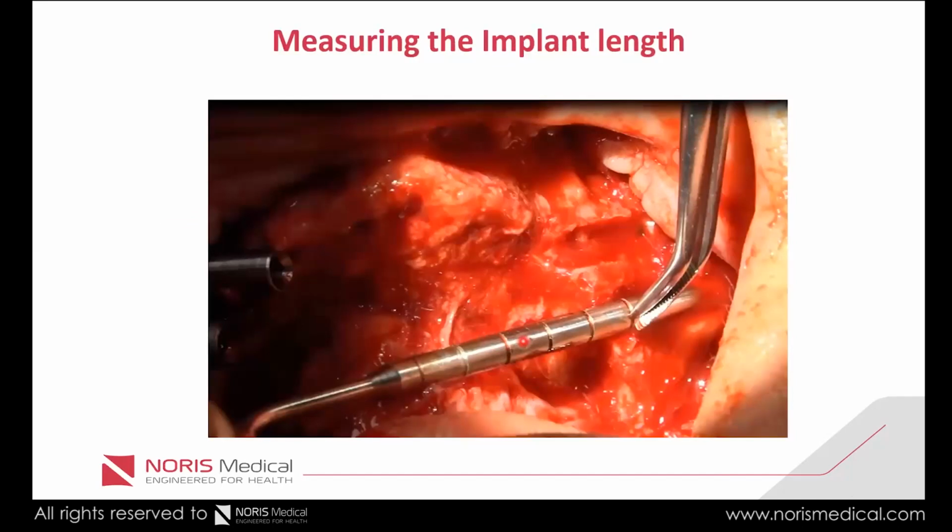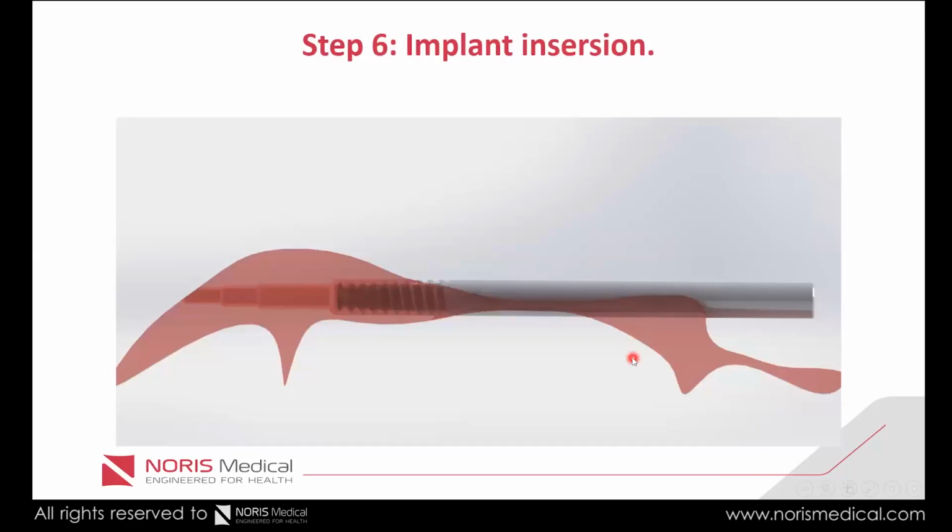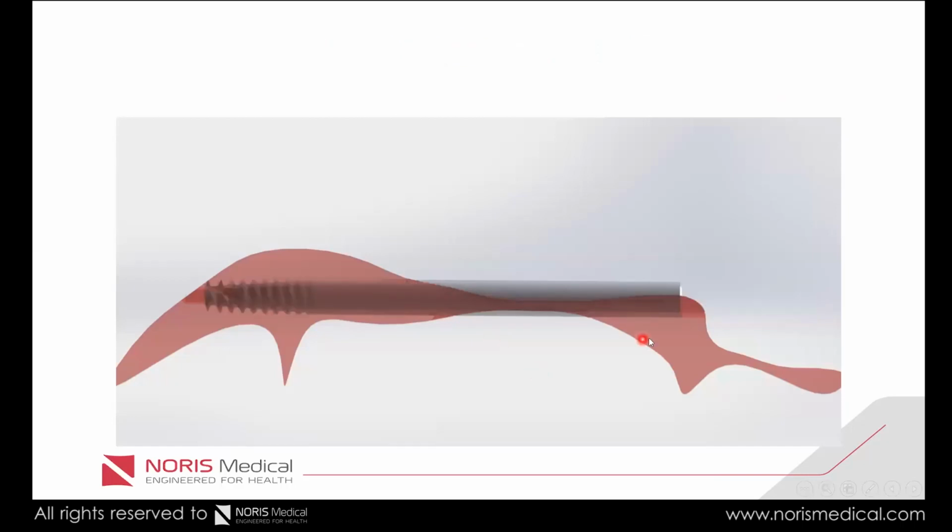And that's actually how it looks. So we're counting the lines and deciding the implant length. Now, placing the implant, basically the implant goes all the way here. This is drilled already, the 4.2 drill. So the implant goes in, and now the threads are going down 2.5, 3 millimeters, going inside. And this is where it went. You see, this is the distance leaving us for the multi-unit, and the apex of the implant is exactly at the point where we want to have it.